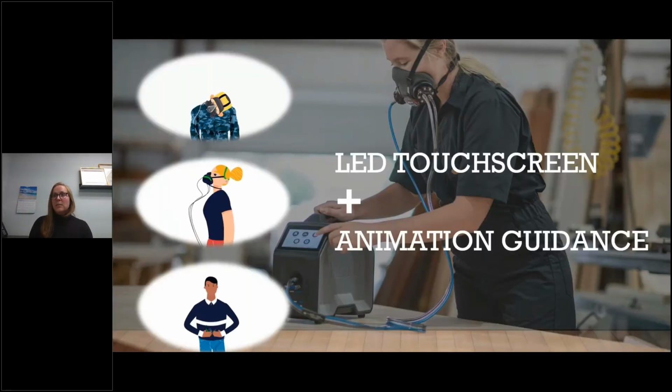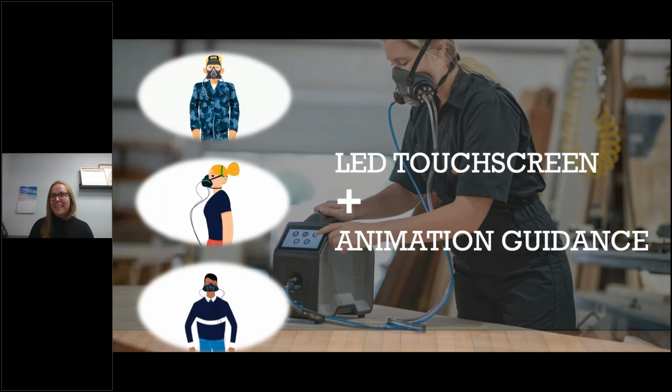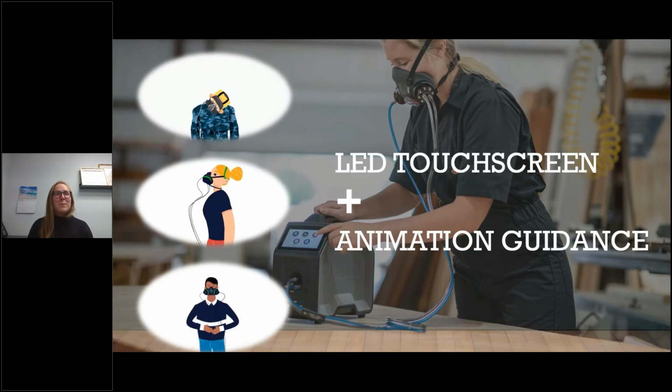So you can see the touch screen. I mentioned it's called touch screen, so it can be hand operated, and that's what Sarah here is doing. But you could also use a personal stylus because there is the option for the on-screen signature capture.